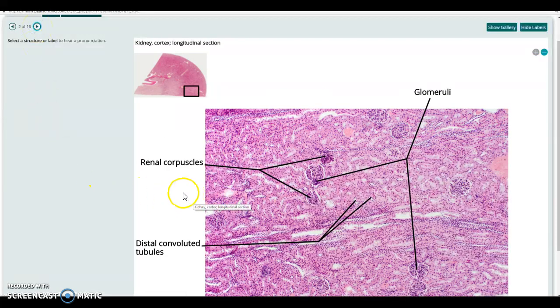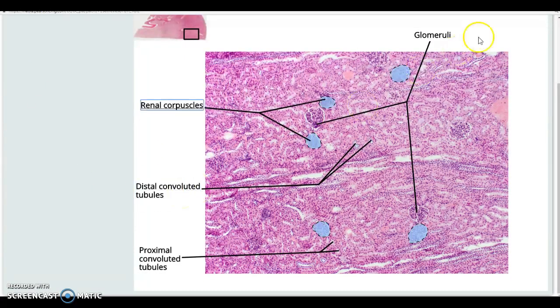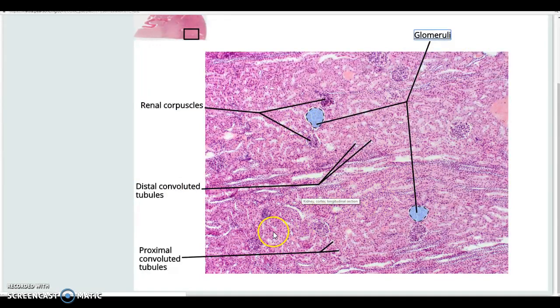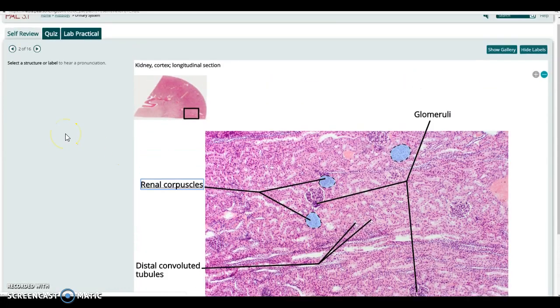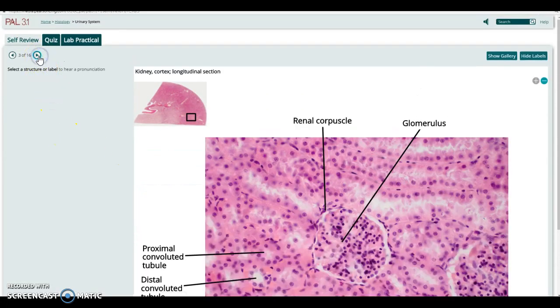Here, where you can see the renal corpuscles or the glomeruli or Bowman's capsules, you should be aware of those because they really stand out in the kidney tissue. But understanding the rest of the ducts and tubing, it gets to be quite complicated. So that's a good one.